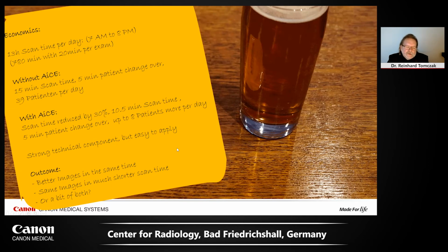The outcome, or the conclusion of this talk, is you can get better images in the same time, or you can get the same images in a much shorter scan time, or you can mix it up a little bit. You can do it like you want.